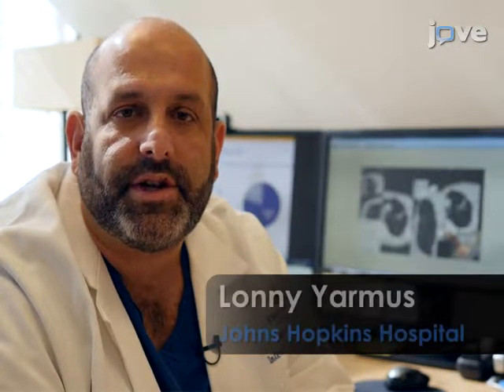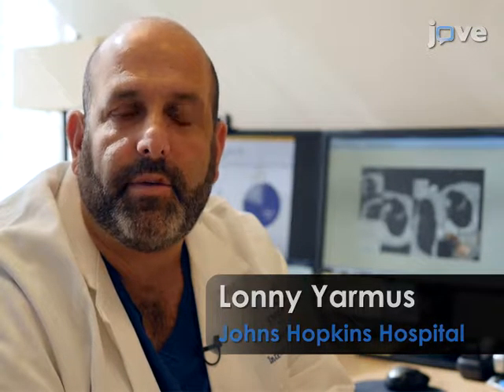Demonstrating the navigation-guided percutaneous lung biopsy will be myself and Dr. Sixto Arias, Interventional Pulmonary Fellow at the Johns Hopkins Hospital.